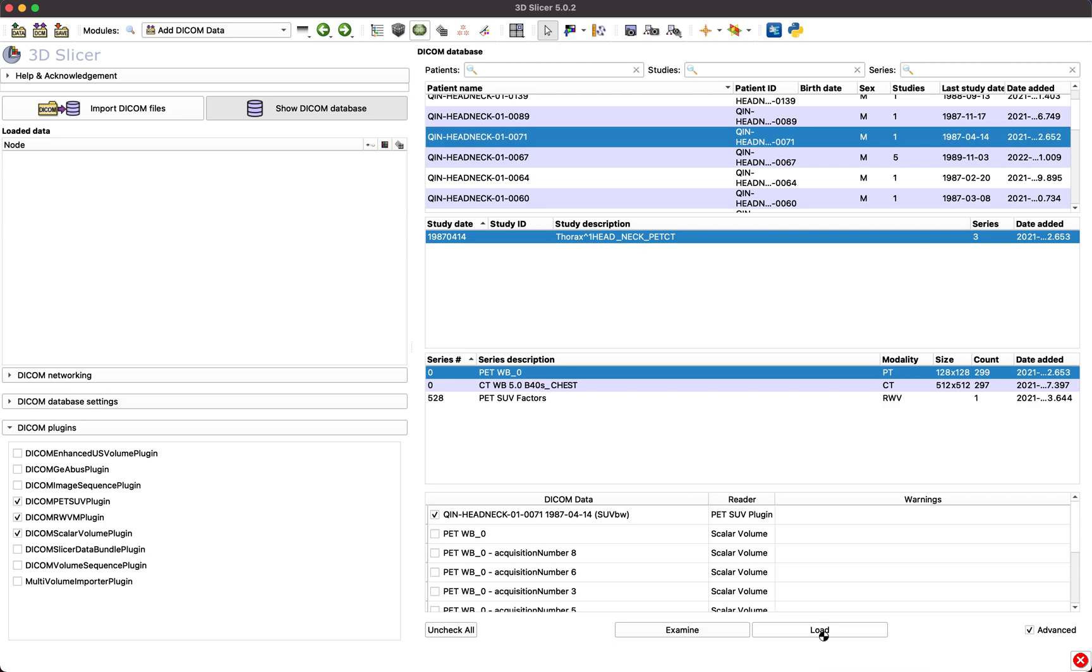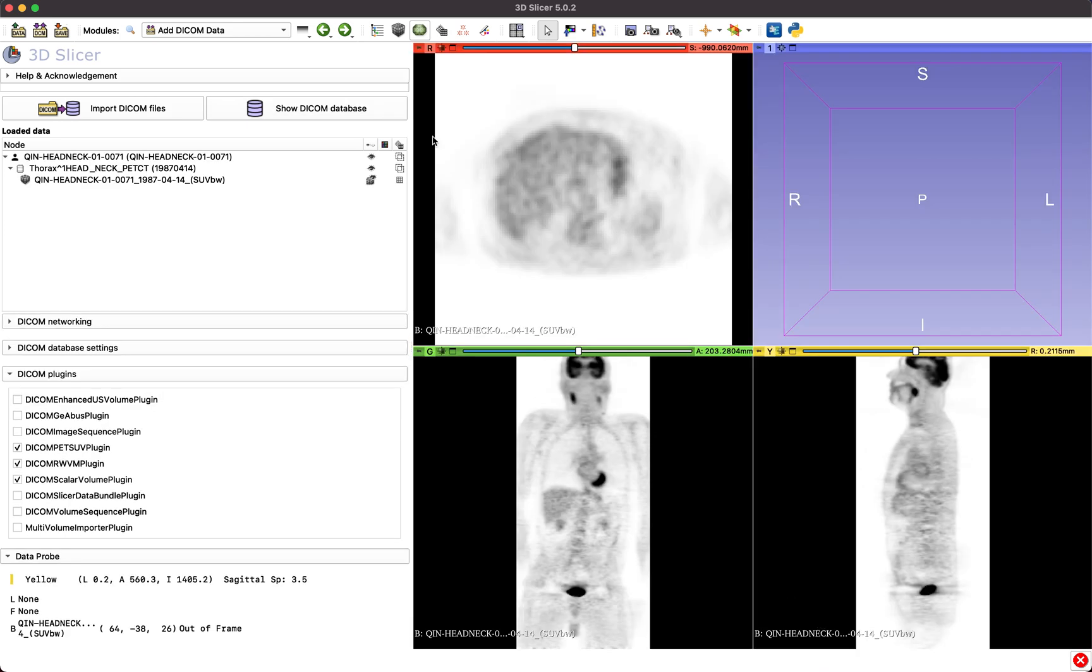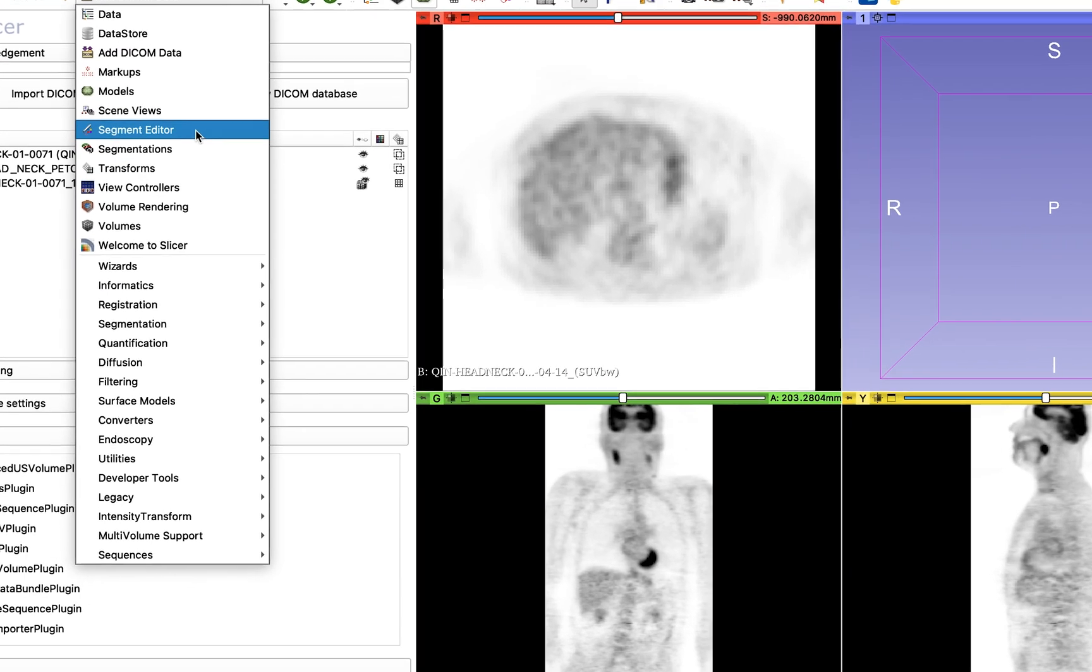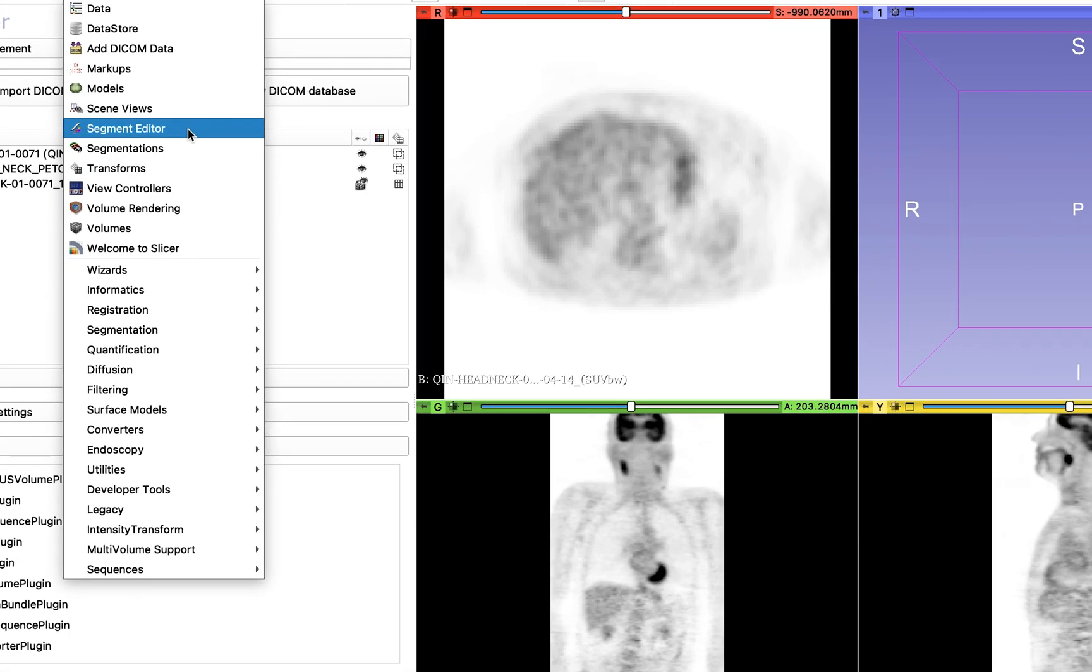Once the dataset is loaded, select the Segment Editor module from the module selector.